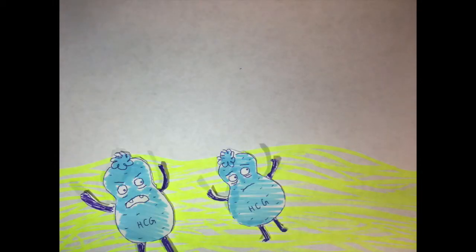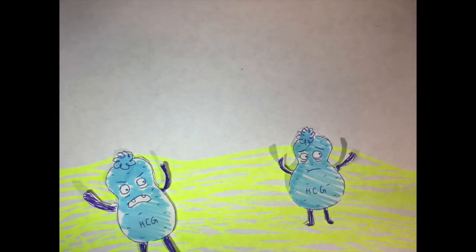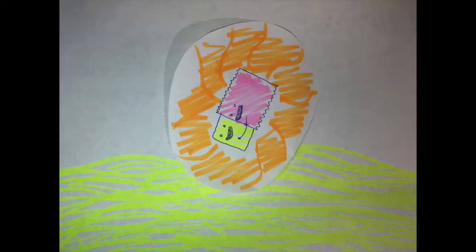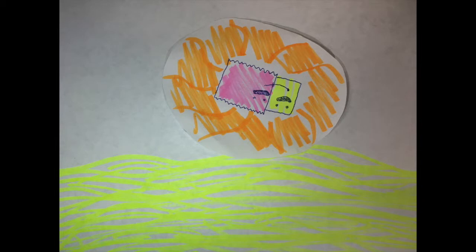When you urinate on the stick, your urine travels up 3 zones of the stick, where the stick is trying to detect the presence of HCG, a hormone produced in the earliest stages of pregnancy. In the reactive zone, AB1 antibodies locate any HCG hormones and bind to them. In the test zone, AB2 is another antibody that binds to one of 5 binding sites of HCG, creating a sandwich. This leads to the dye-activating enzyme, which is attached to the antibodies, to activate, creating a visible pattern that can notify you if you are pregnant.